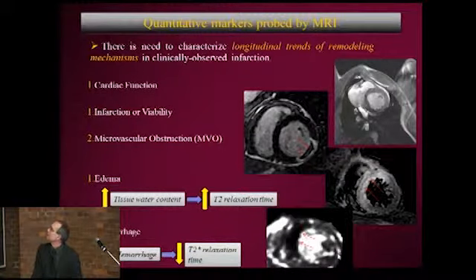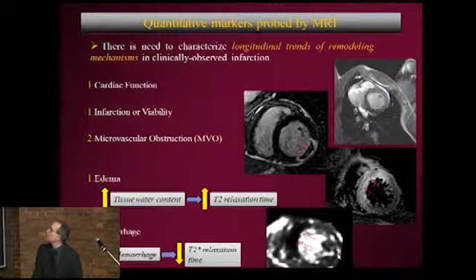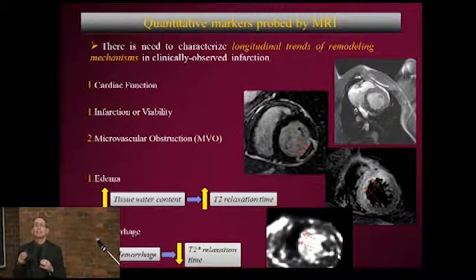Finally, another thing MR can look at, with another contrast mechanism referred to as T2 star, is areas where there might be iron deposition, which is messing up the magnetic field. T2 star is, again, a signal decay constant, which says how fast the signal goes away due to field disturbances. Here you may see a darkened region due to the accumulation of hemorrhage in some cases.